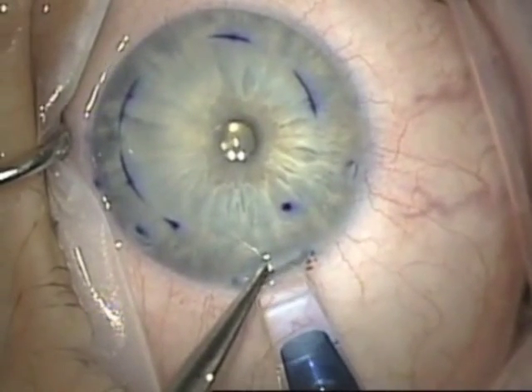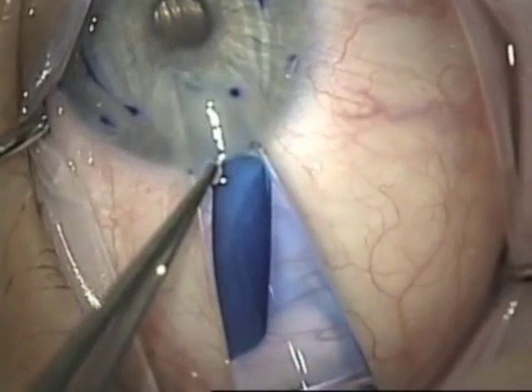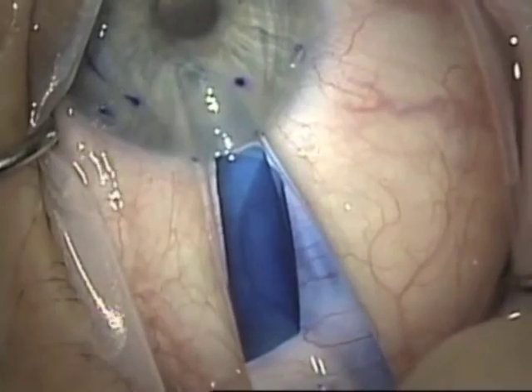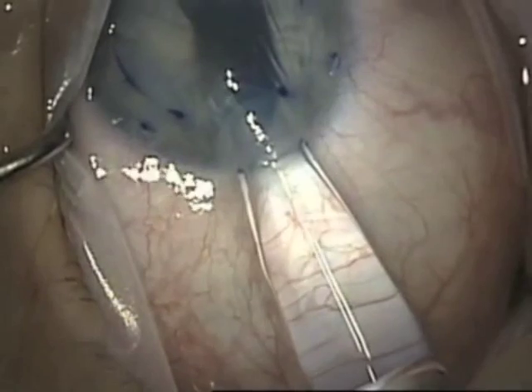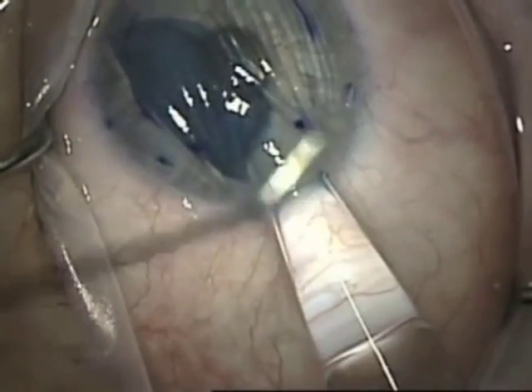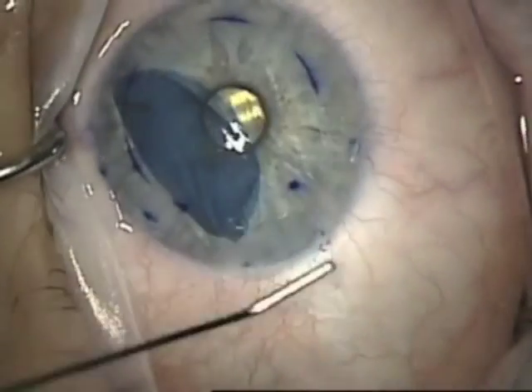This is my fellow using the injector. There's no air, preferably, in the system, and a couple bursts of fluid. And you'll see that graft just goes quite nicely into the anterior chamber. It maintains the anterior chamber volume. You have to be careful not to over-pressurize the anterior chamber, and then carefully bring the injector out.